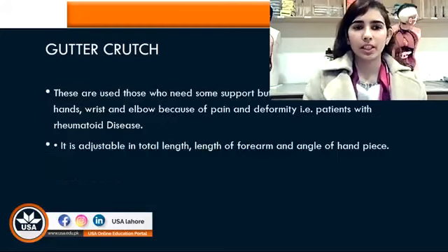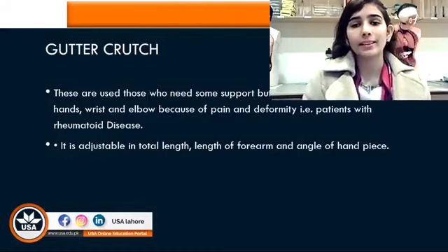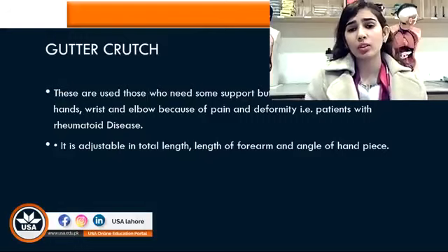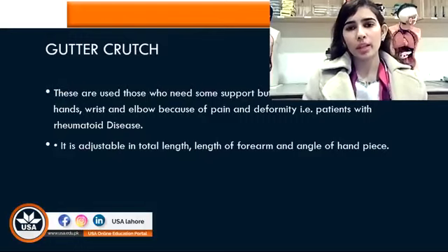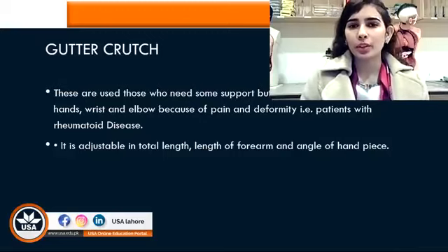So what are the gutter crutches? These are used in patients who have some deformity or problem with the wrist and elbow, which are painful, and who say that they cannot hold their whole body weight with the help of their hands, such as in rheumatoid arthritis as well.